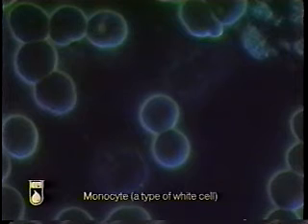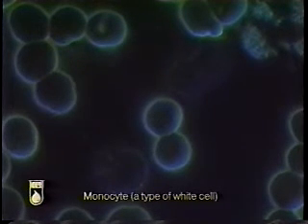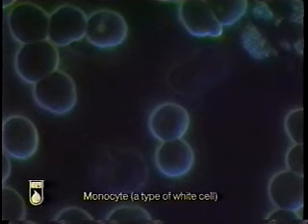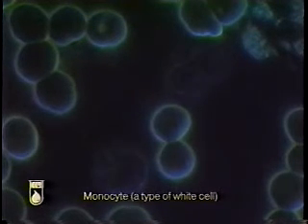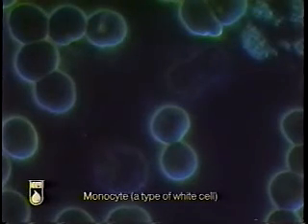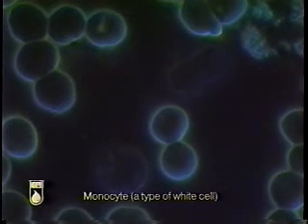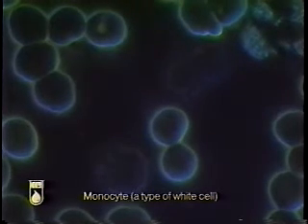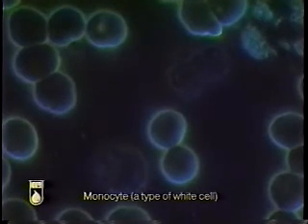Seen here in this image are a pair of monocytes scattered among some red blood cells. This population of white blood cells is responsible for helping to identify foreign materials and toxic substances. It will in some cases phagocytize foreign material and is responsible for templating and preparing foreign material so that lymphocytes and other white blood cells can carry out their functions.